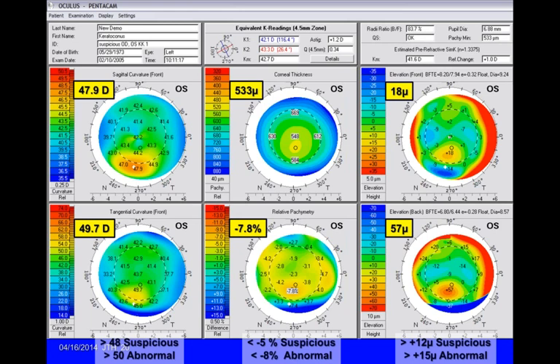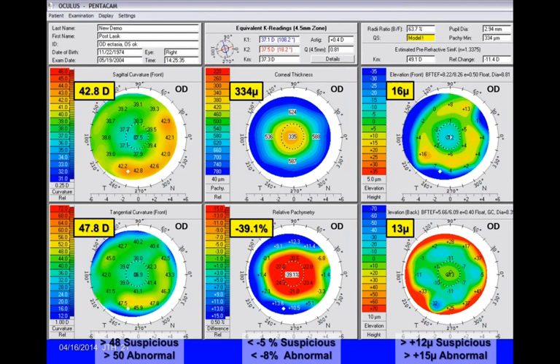Looking at the lower right-hand corner of the left eye of that same patient, it shows 57 microns on the elevation map—clearly elevated. This is a keratoconus, with 18 microns on the front elevation, because the epithelium is being rubbed off above. The 57 microns on the back surface definitely indicates a cone. It's always more sensitive in terms of elevation being higher on the back surface when it's a cone than on the front.